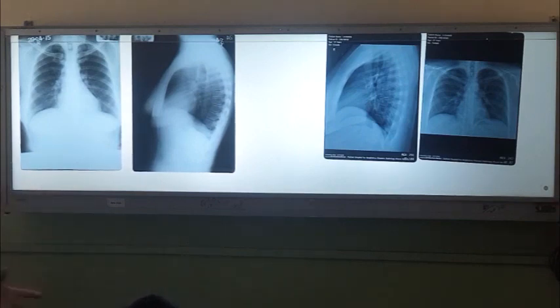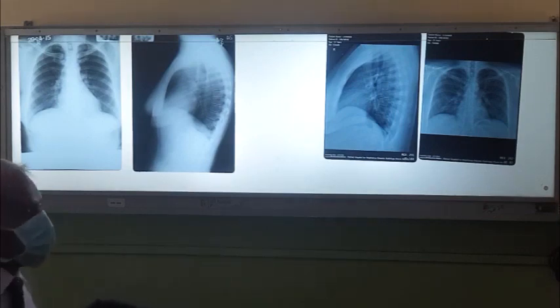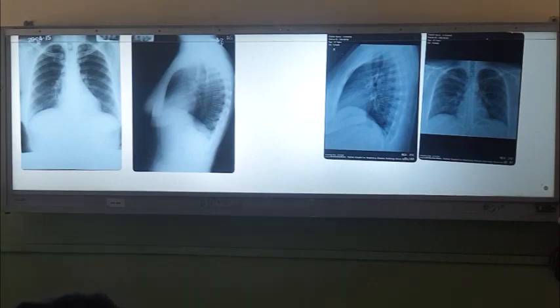If the patient has backache, the primary malignancy or TB may be in the lungs. So don't do other X-rays without doing a chest X-ray. We have seen examples where some people do CT brain, MRI, everything, and finally a lung cancer is seen on the chest X-ray several weeks later.